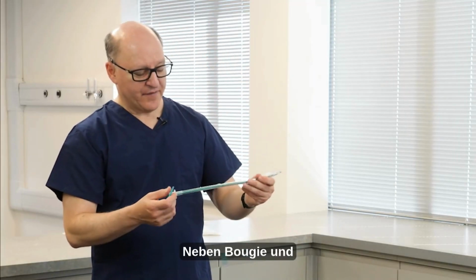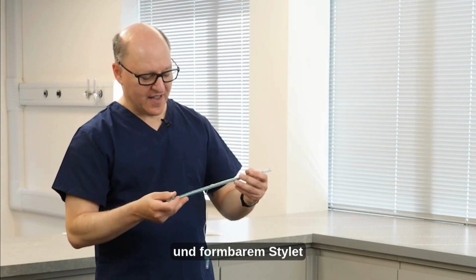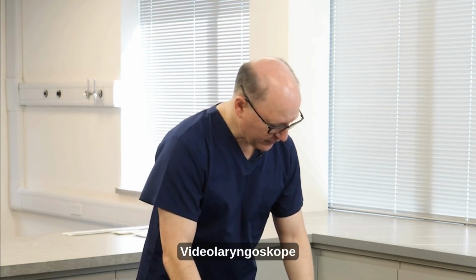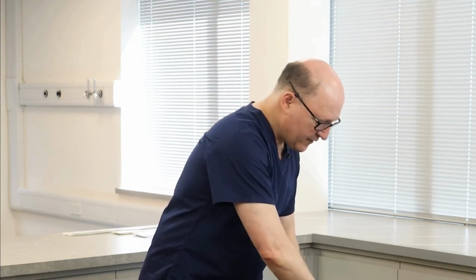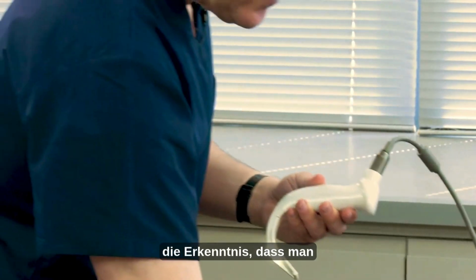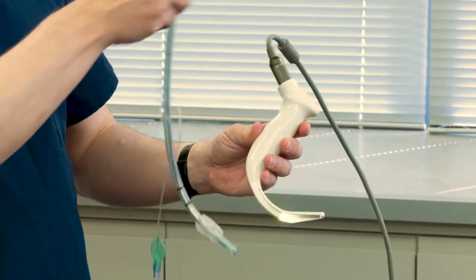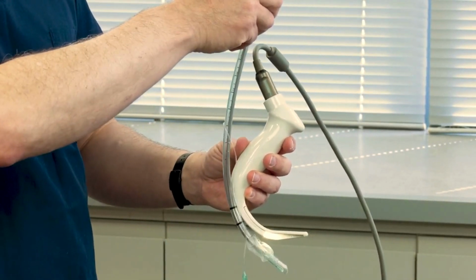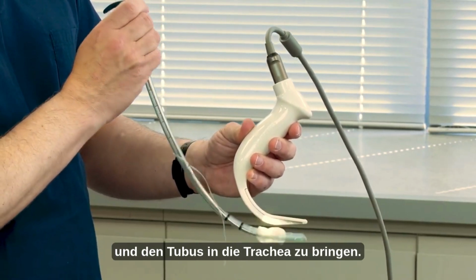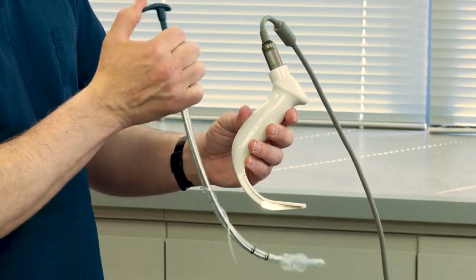But in addition to having a Bougie, having a malleable stylet, when we introduced hyperangulated video laryngoscopes, the first of which was the GlideScope, Jack Pacey realized that it was useful to have a rigid stylet to introduce this, get around the curvature of the blade, and then pop this into the trachea and to introduce the tube that way.